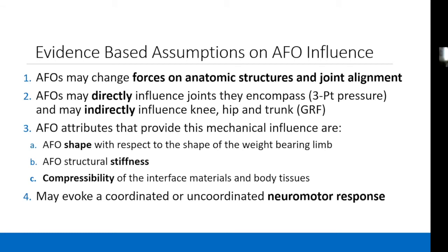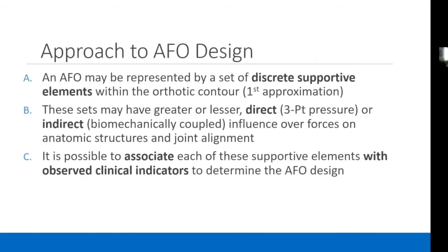It's also something that is becoming increasingly clear that AFOs evoke a coordinated or uncoordinated neuromotor response by virtue of the way they position the limb, by virtue of the way that they resist ankle motion or are positioned, and the amount of range of motion that is also allowed to occur.